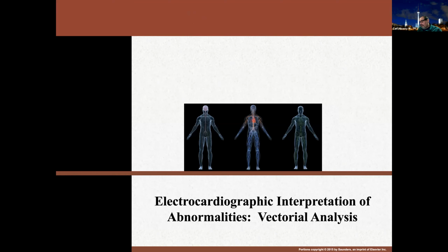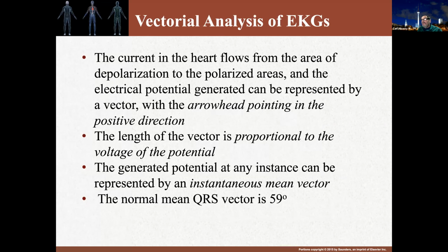So let's look at some abnormalities, particularly of the heart, and vectorial analysis. And the first thing we're going to do is try to determine the mean electrical axis of the heart. This is, in fact, something that I think I have you do in lab anyway.